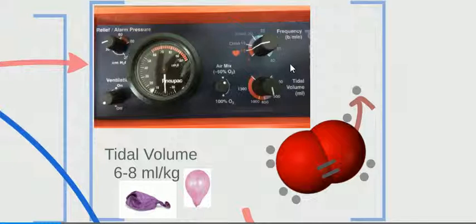So our protocols state, and I actually back this, that our ventilator not be used on anybody under the age of 12. That's just to prevent barotrauma. Because let's say we put it to 30, but we're unable to hone in on the exact tidal volume. It just gets a little risky in the end, so it's really not worth it. It's just better to bag them than to use the ventilator.